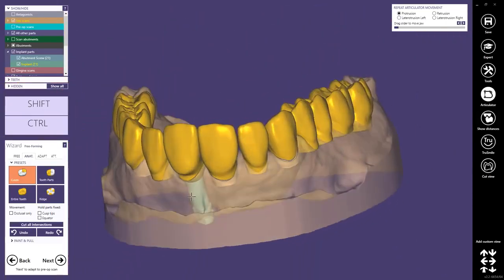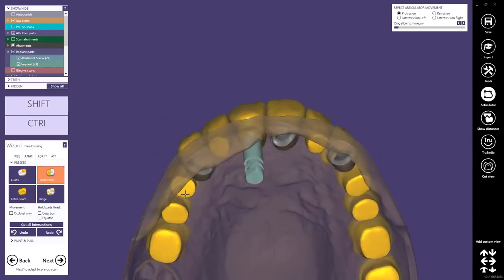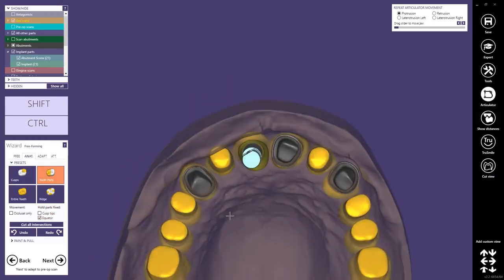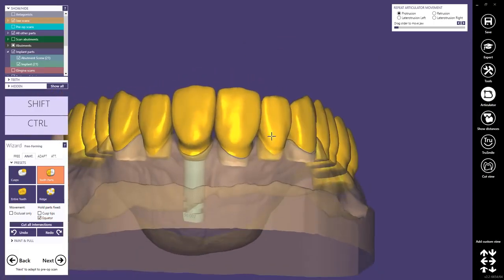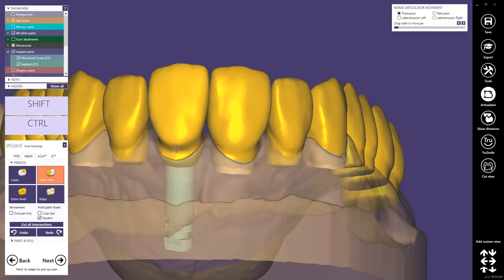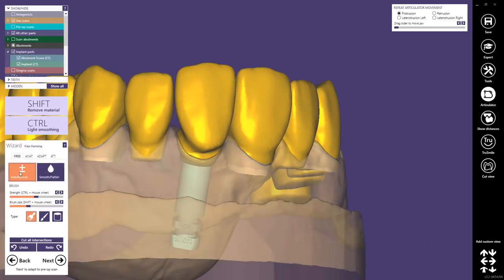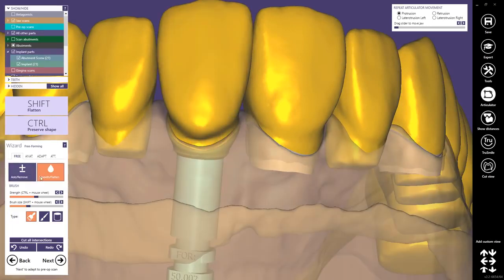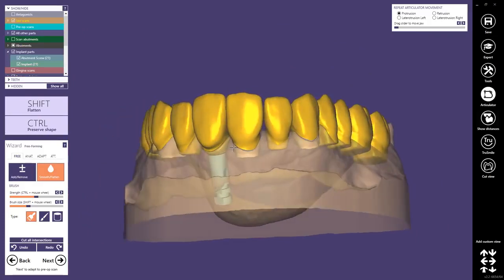In this step we can do some freeforming. Usually I just take the basal parts of my Pontics, I fix the equator, and then I move these parts here into the jaw. You can also add or remove and smooth and flatten. Don't be too critical here in the design, because in any case it will be reduced later.